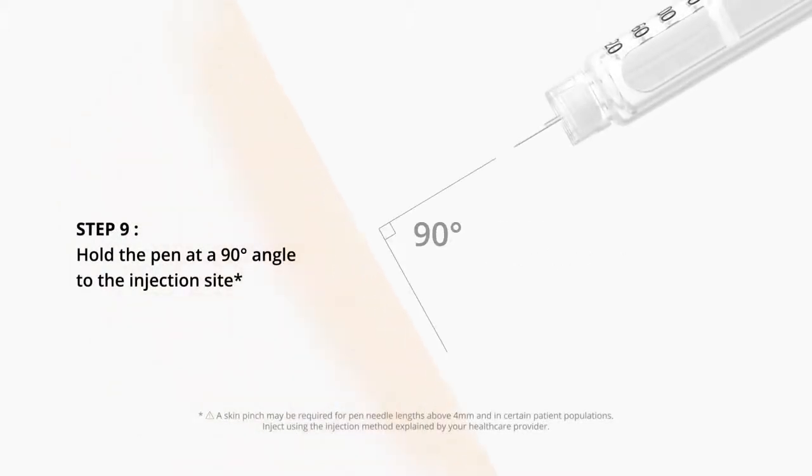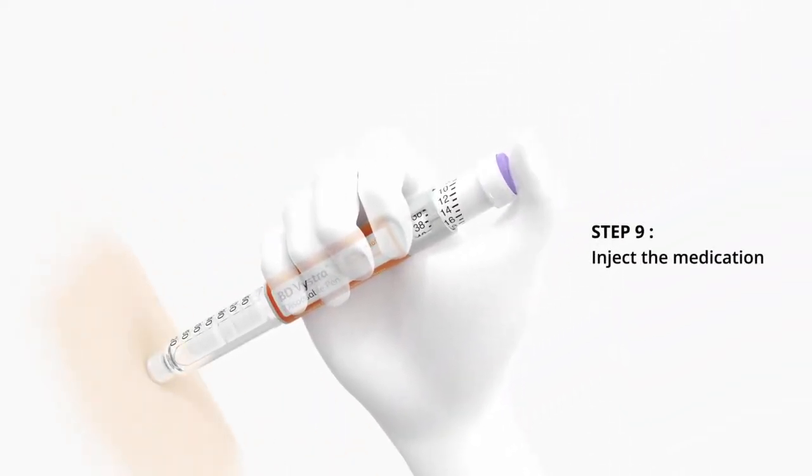Hold the pen at a 90-degree angle to the injection site. Inject the medication.